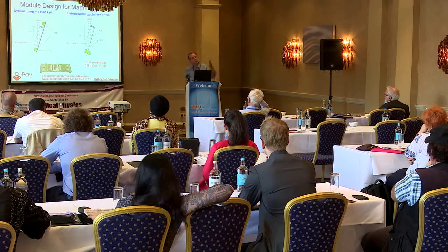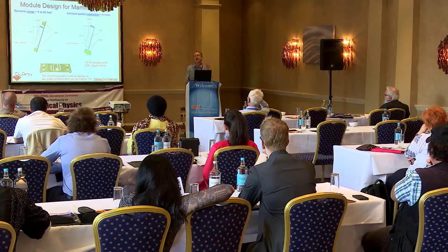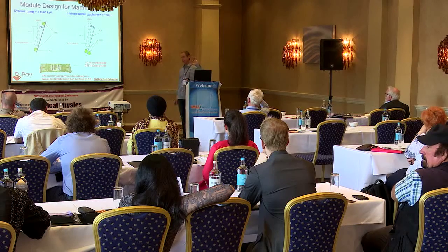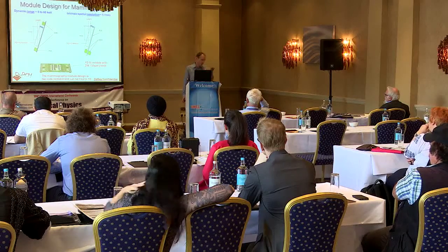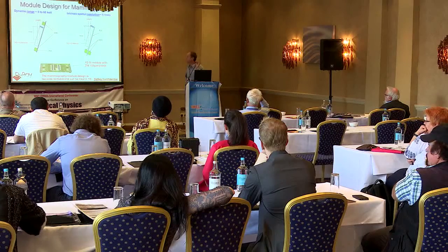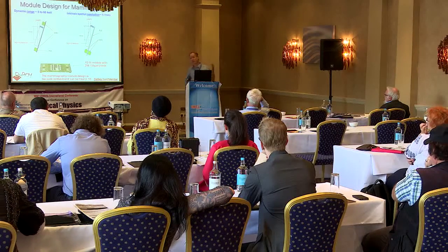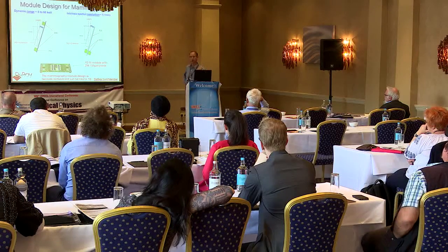Silicon does not have this charge sharing effect at these energies, okay? But silicon has a very, very low Z, so it doesn't have a lot of stopping power for X-rays. So we need a very, very thick piece of silicon. A centimeter thick would be nice because it would have a good DQE for the beams that are used in mammography. But you cannot make silicon junctions that are larger than a millimeter, because you need to fully deplete the silicon so that you can collect the charge that's generated.